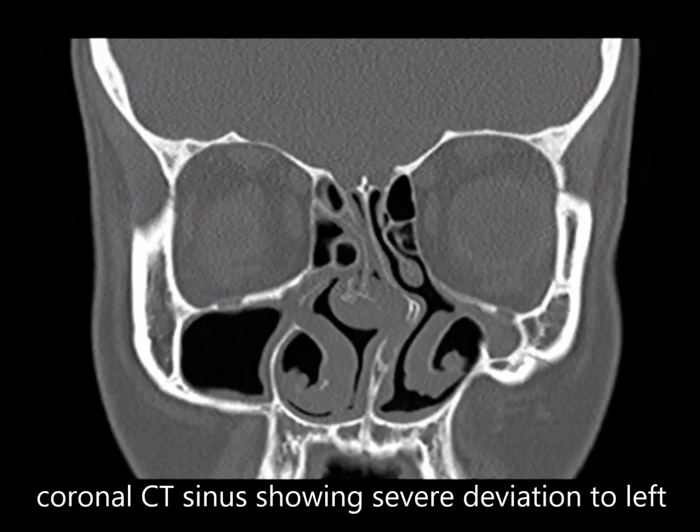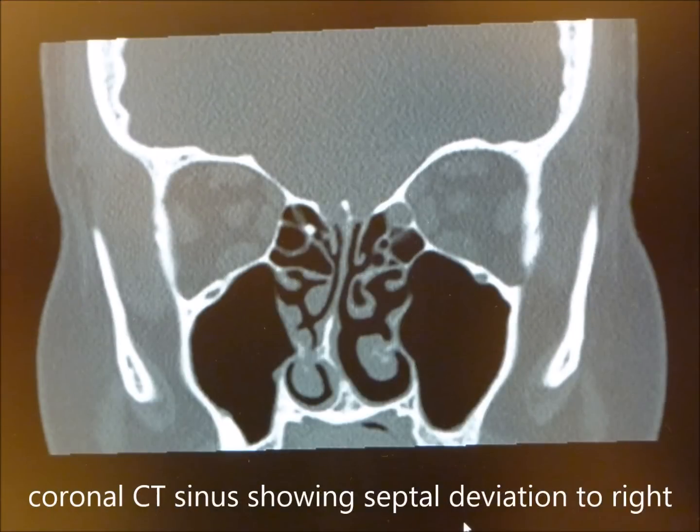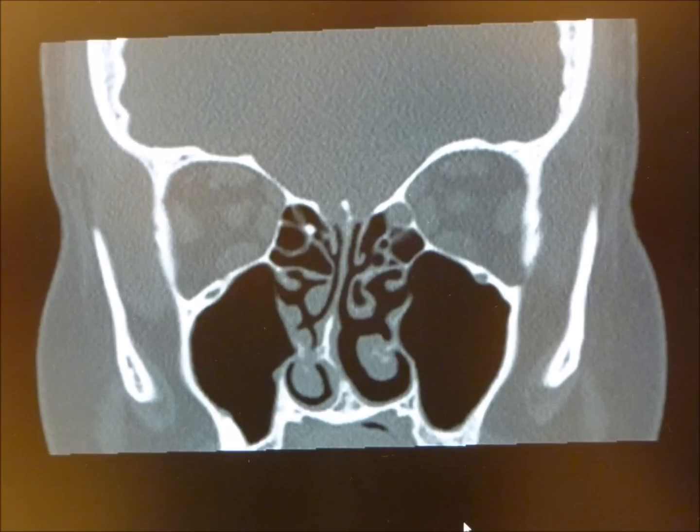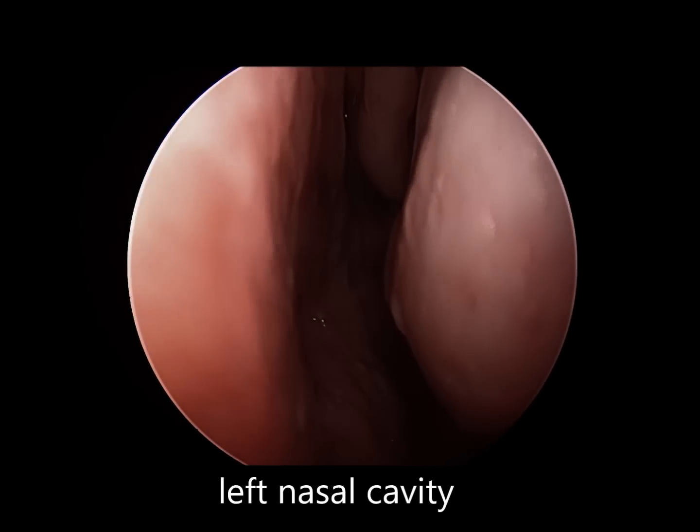This coronal CAT scan image depicts a very severe septal deviation towards the patient's left side, as well as maxillary sinus atelectasis. And this CAT scan demonstrates a more moderate deviation towards the patient's right side, and this CAT scan image actually depicts some of the clinical video that we have showing a patient's surgery, as we're seeing right here.